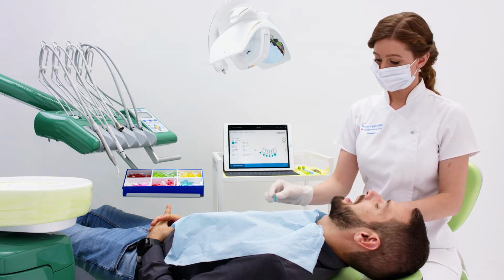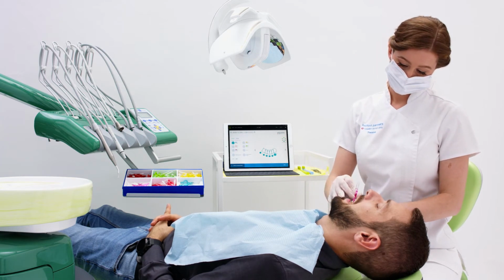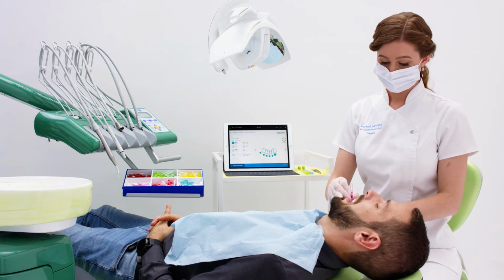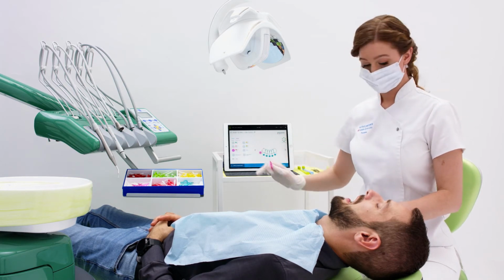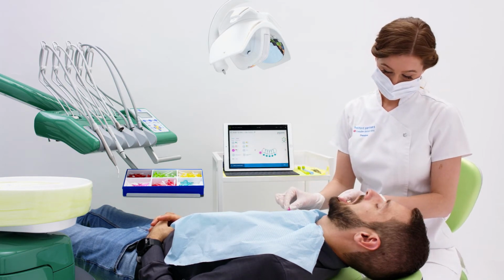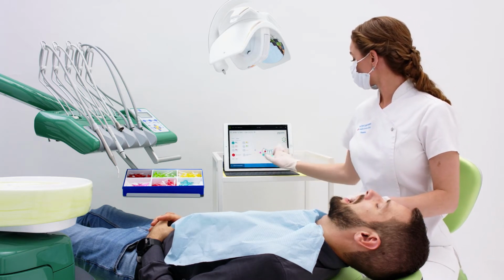When using the turquoise on the lower anterior teeth, I feel that there is one area in which it is now possible to increase the size brush to that of the pink prime. So I change the colour brush here to the pink prime.